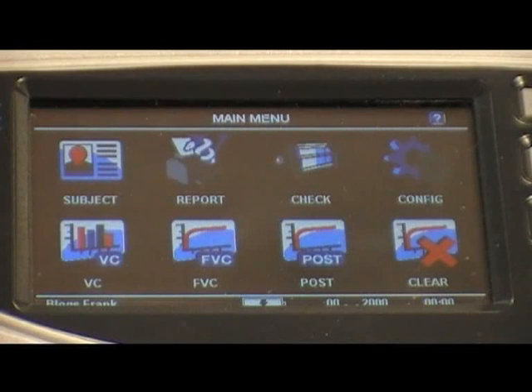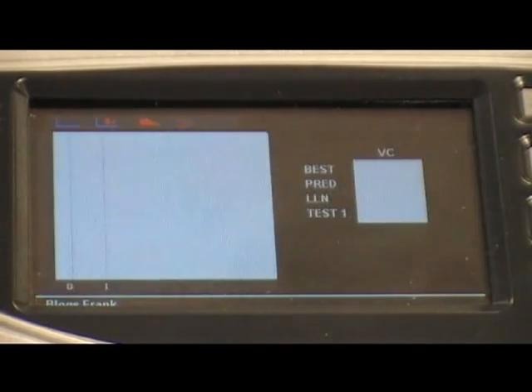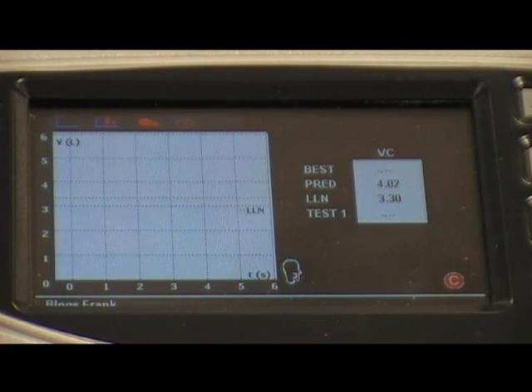To commence testing, click the Vital Capacity icon in the bottom left-hand corner of the screen. You will see a blow symbol indicating that the AlphaTouch is ready and that the subject can perform a blow into the spirometer. We will now perform a VC manoeuvre.